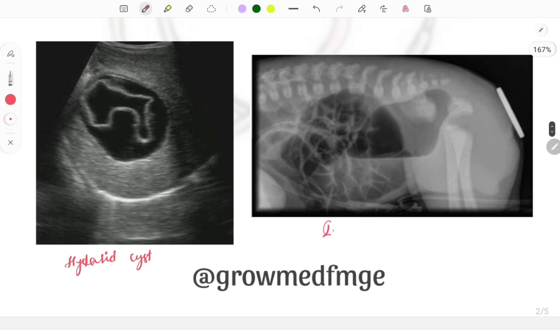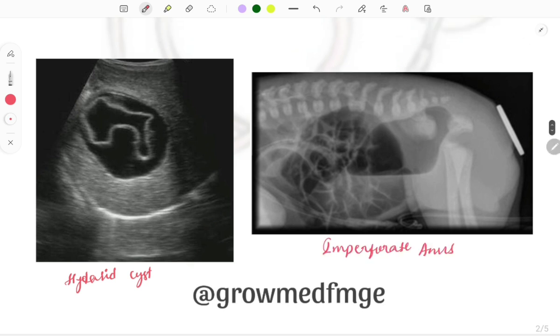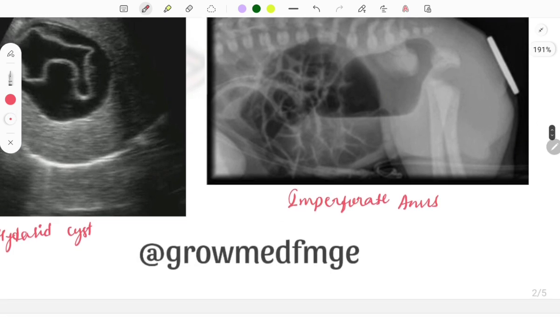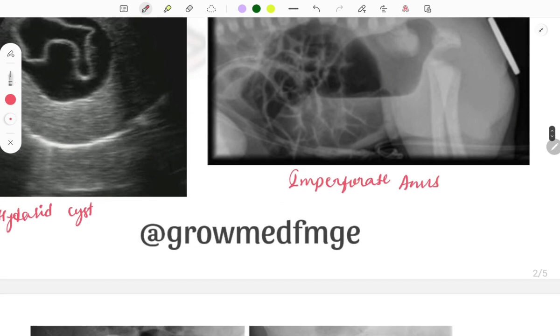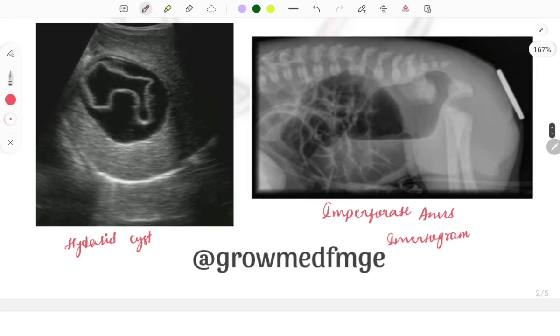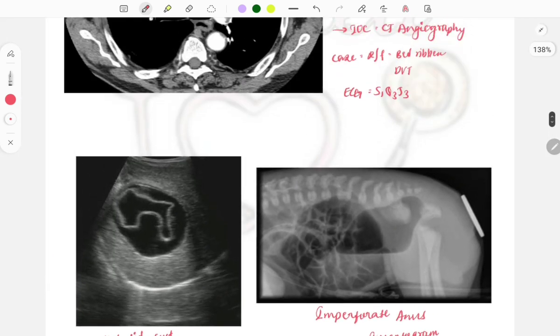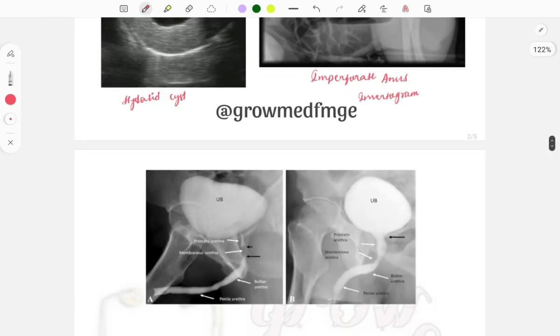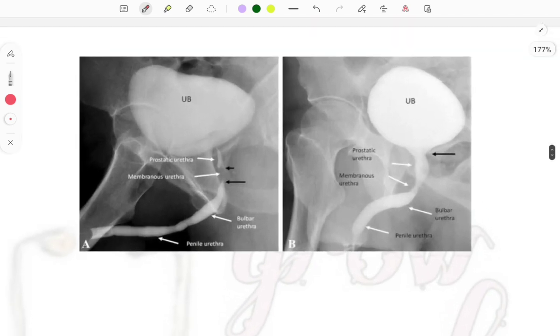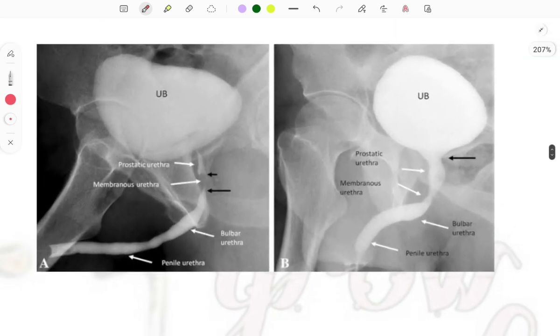This image is of imperforate anus. You can see the invertogram, which is done for imperforate anus to check whether the passage of fluid and gas is present or not, to reach a conclusion about the defect.